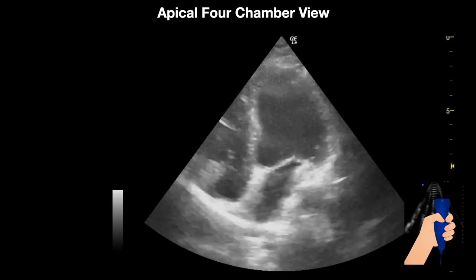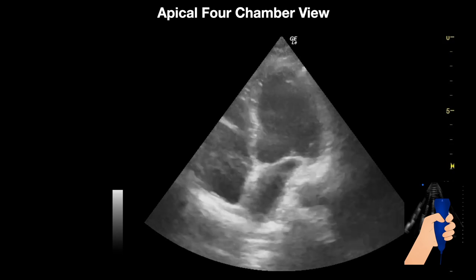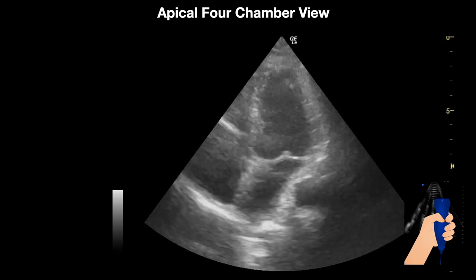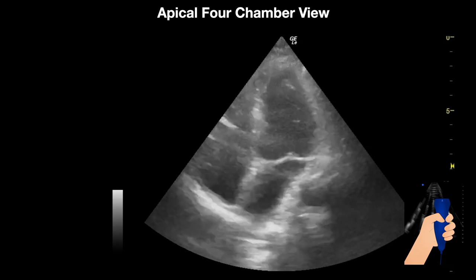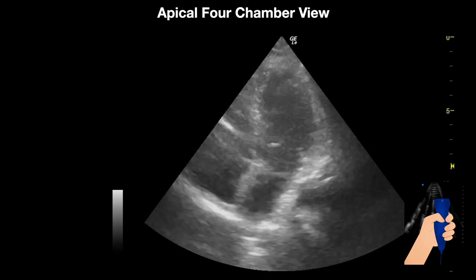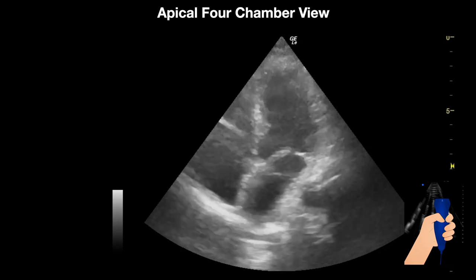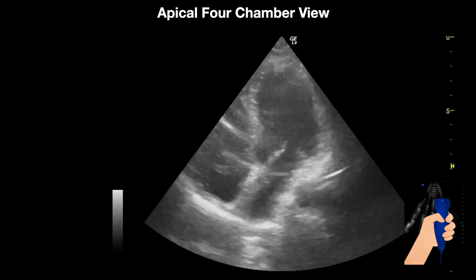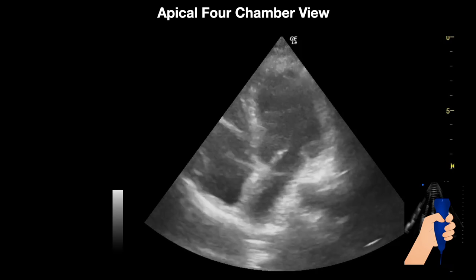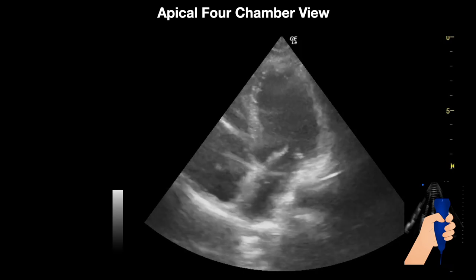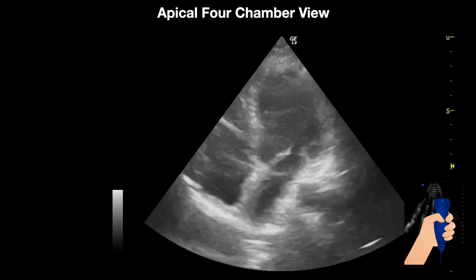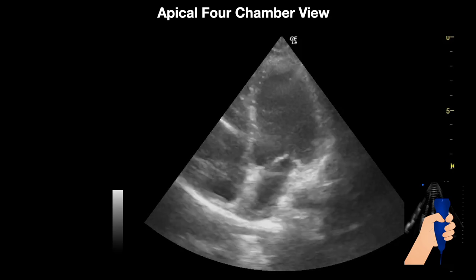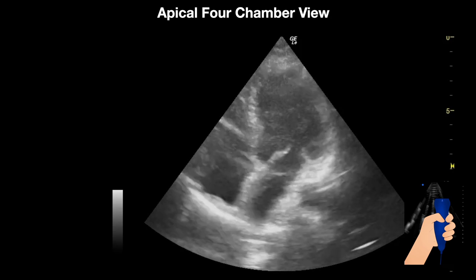This is an apical four-chamber view. In here we see the apex towards or touching the chest wall of the patient, giving us the ultrasound window to image the heart. We are using a phased array transducer with cardiology convention, as you can see here.